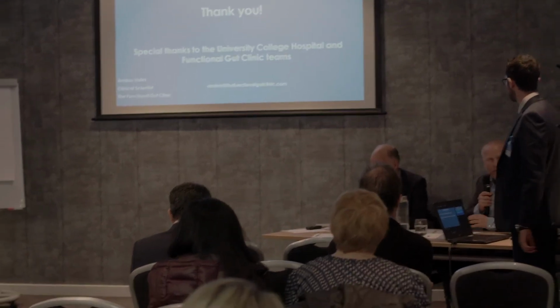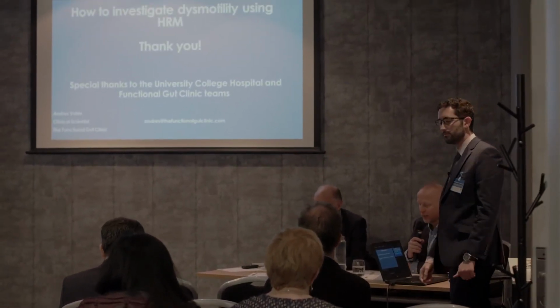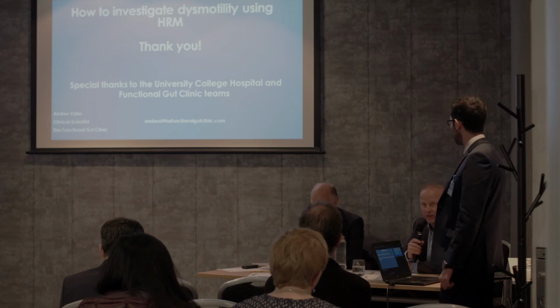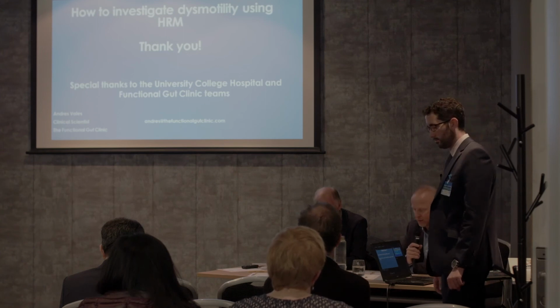I thought your case study was really good, and you showed where the diaphragm was by a big deep breath in. In our unit, and I'm sure some others as well, what we tend to do with everyone is a big deep breath in at the beginning. Give yourself that quality assurance at the beginning that you cross the diaphragm. And also do a big cough. It sounds simple, but it's another quality assurance to check that all the sensors are working.